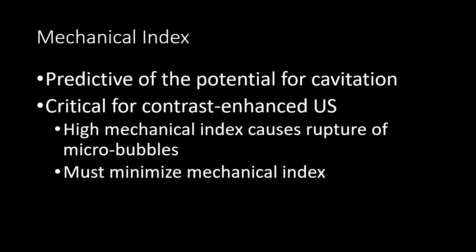An advantage of contrast-enhanced ultrasound is that we can turn up our mechanical index, cause the microbubbles to all rupture through cavitation, and then we can re-inject the patient with a new dose of microbubbles and re-image an organ, a structure, or look at a different lesion than was in our field of view on our first pass.